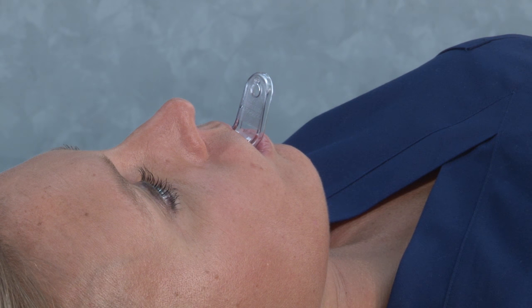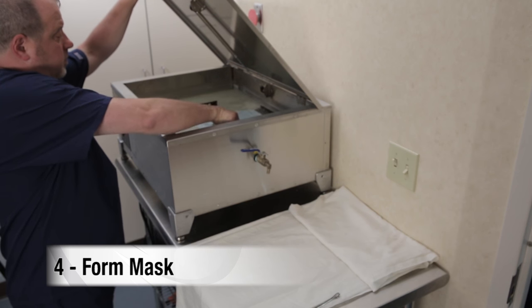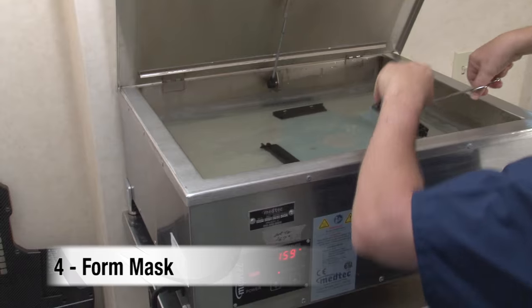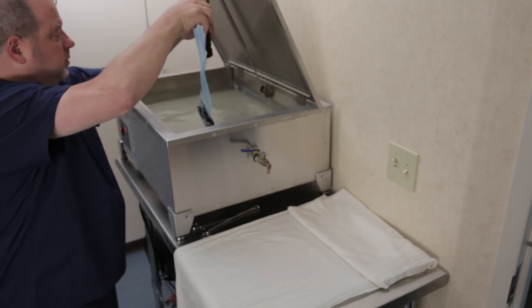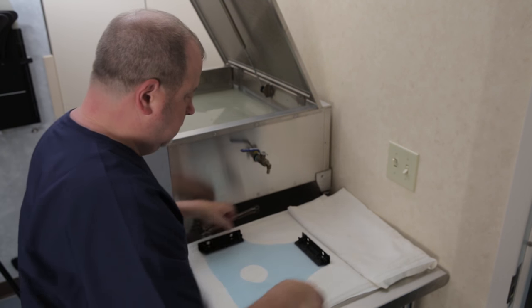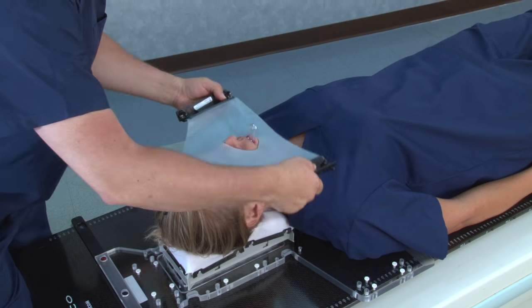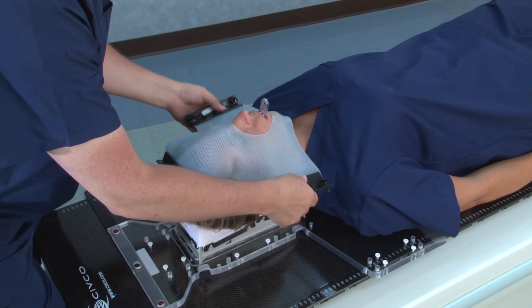To form the thermoplastic mask, place the mask into the water bath. Refer to your manual for heating times. The bite tray should be in the patient's mouth with the jaw relaxed. Then, remove the mask from the water bath and remove excess water. Pre-position the mask over the patient's face, focusing on the forehead and chin and avoiding contact with the bite tray.